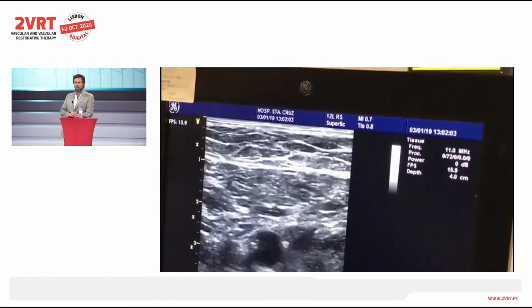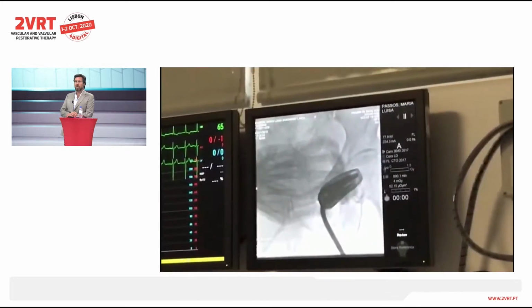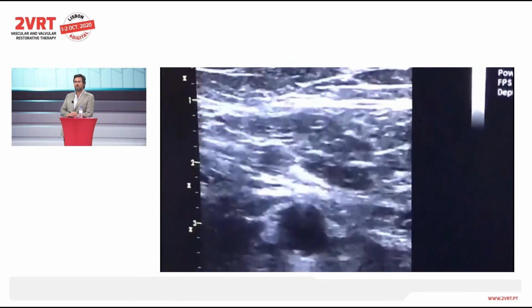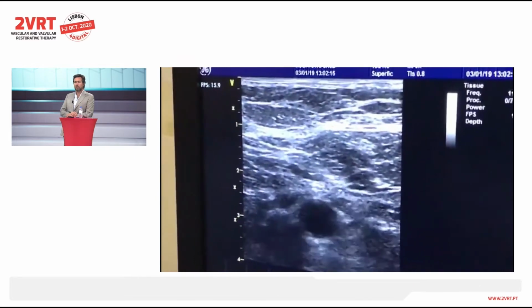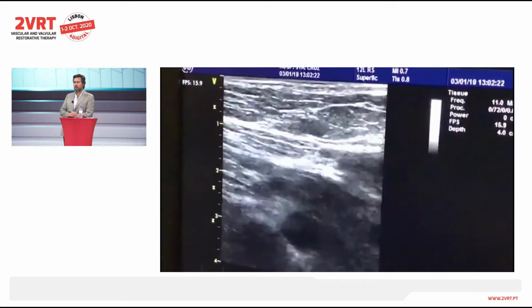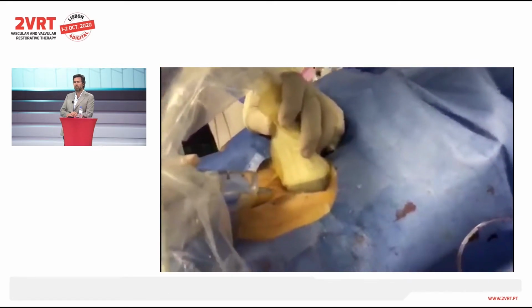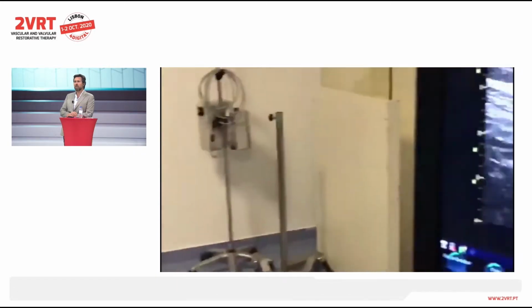We use the ultrasound, we can see the calcium or not, and we always do it together with the fluoroscopy to make sure that, besides being in a good position for the artery without calcium, we're still in the place where it's more compressible. Sometimes with the ultrasound we have a beautiful artery, but we're still too high or too low in the groin. So it's important to do it all in conjunction.